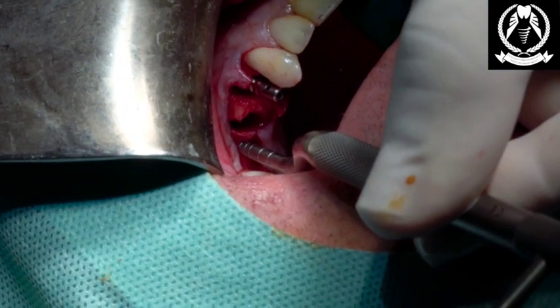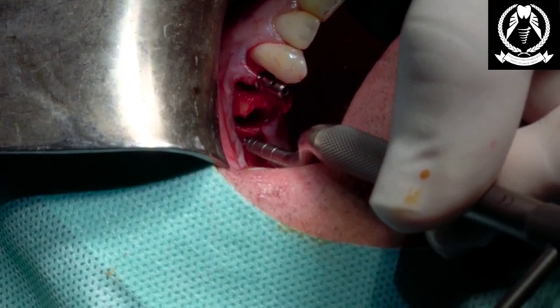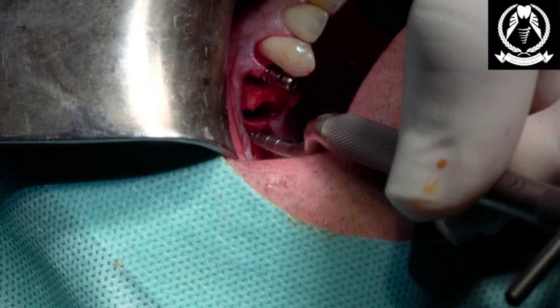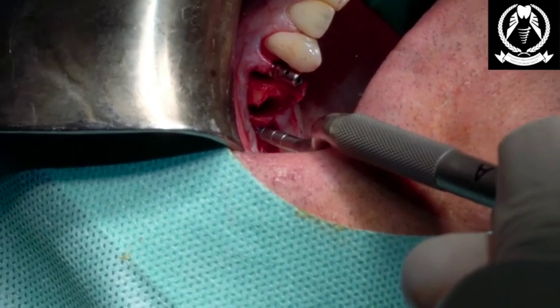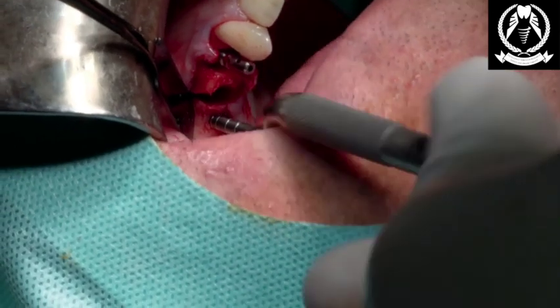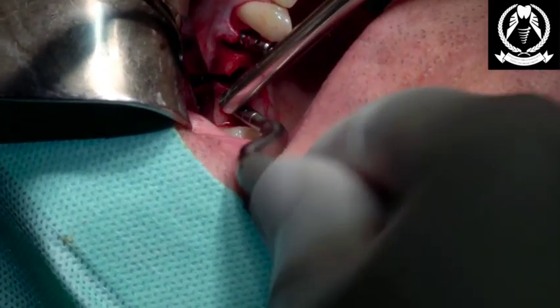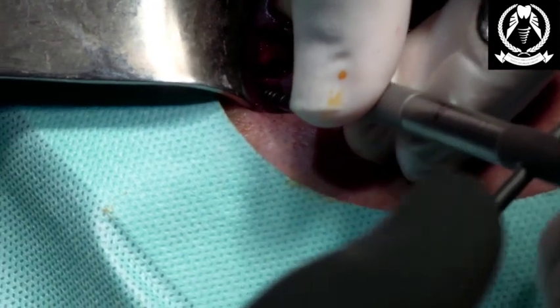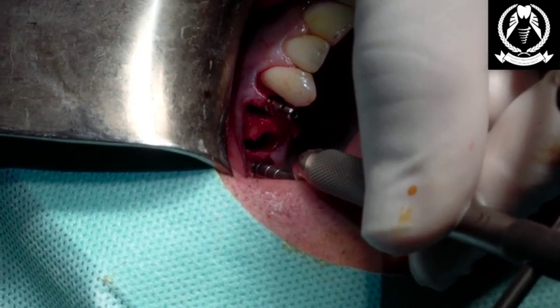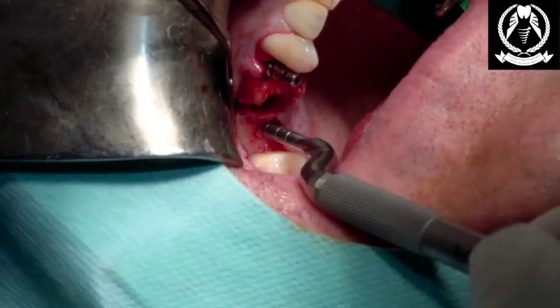So we're condensing the bone, waiting for it to relax. Change of tone. Crack open the implant. Okay, so that is solid Scottish bone there, Alan. Look at that. Yeah, you're good. Suction. Okay. That's the sinus lift done. Beautiful. Just going to relax that out.